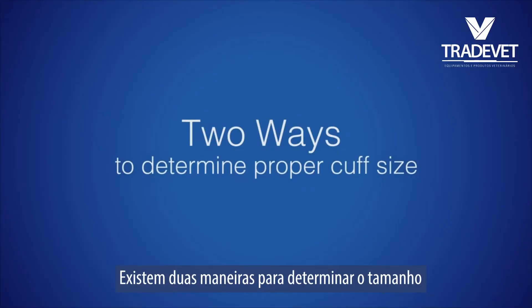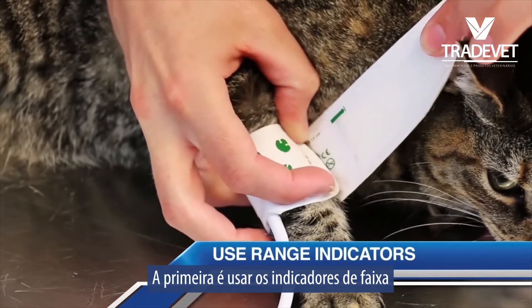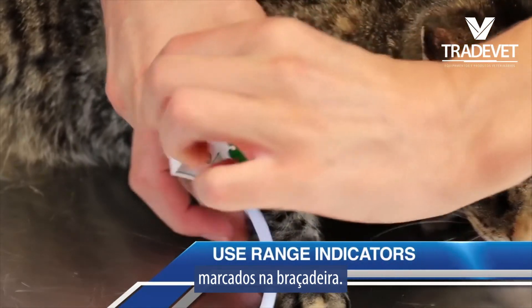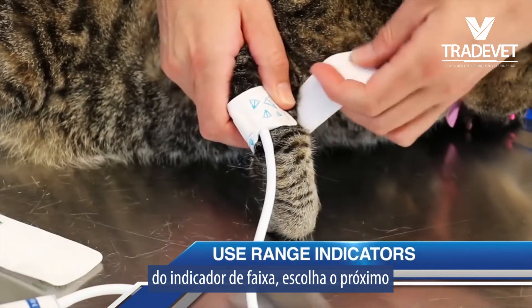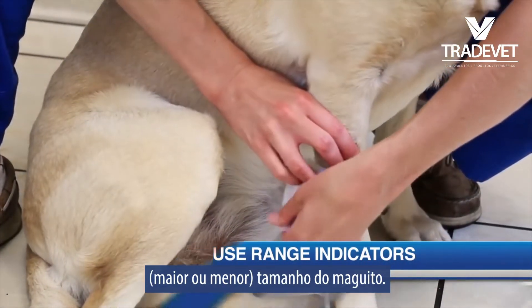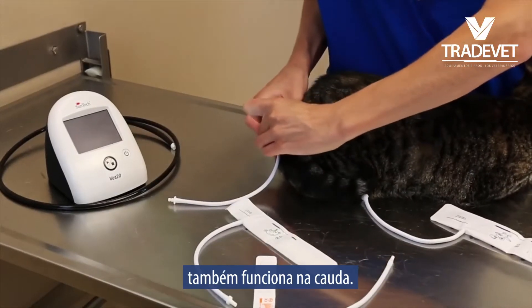There are two ways to determine the proper cuff size for your patients. The first is to use the range indicators marked on the cuff. If the index marker falls outside of the range indicator, choose either the next largest or next smallest cuff size. This cuff sizing method also works on the tail.